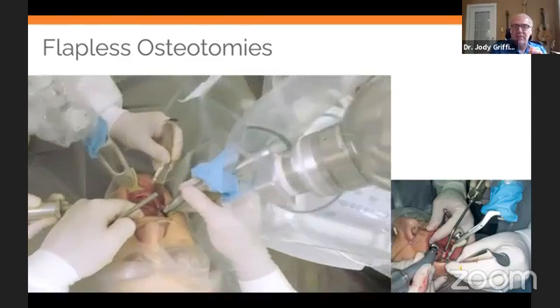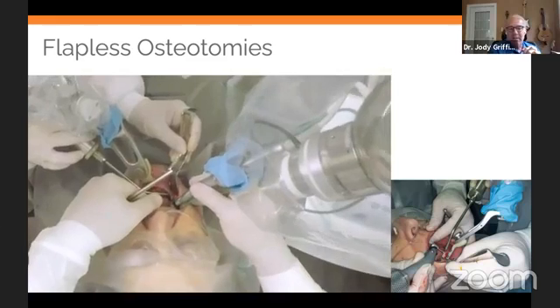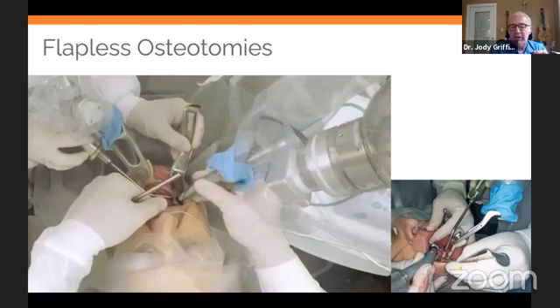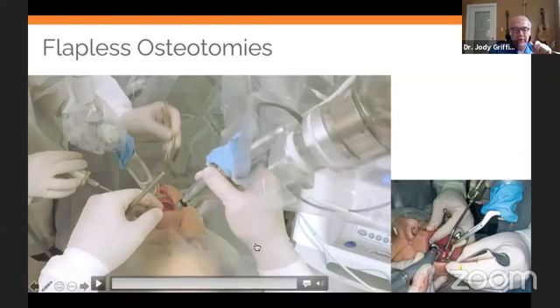That's a great question. It's called a landmark check, and you cannot proceed into surgery without doing it. For a single implant, you would use a tooth that's not covered by the splint. I typically use a cuspid, and I'll go to the cuspid tip, and literally, she'll say landmark check, and you tell her the length of the burr. So it's a 21 millimeter length burr. Then you go to where you place the landmark, and it will give you a confirmation number. It actually quantifies it and gives you a number, and that way you know you're in the right position.